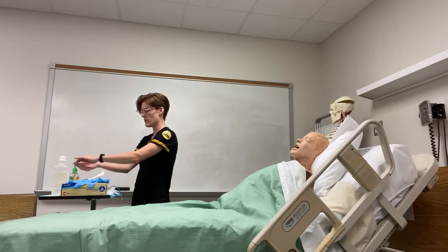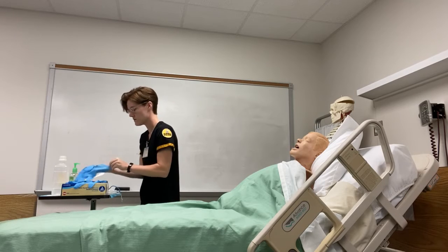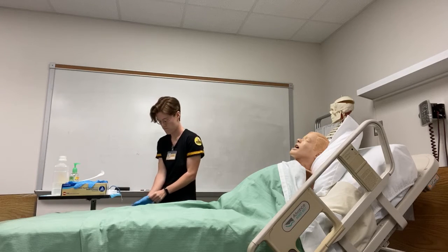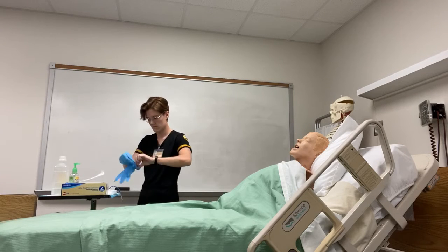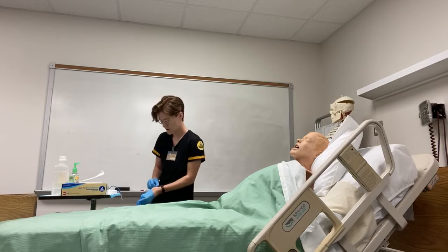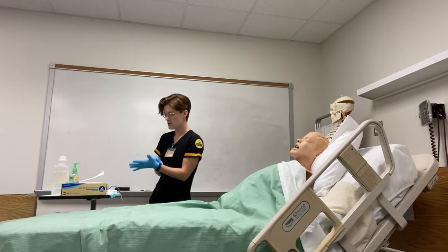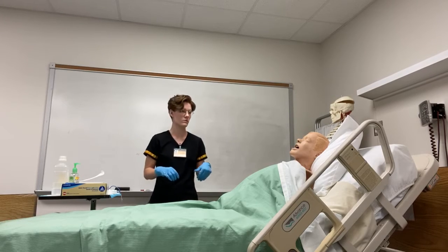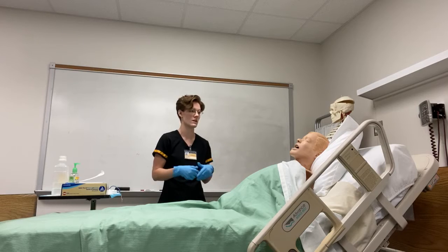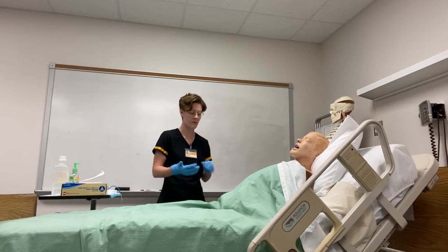so next thing I'm going to do is I'm going to come and wash my hands, and I'm going to apply clean gloves. And did you have any questions before we start? No, I don't think so. Okay, and just to go over some basics, you might feel a little bit of pressure whenever I do insert the tube. It's totally normal. Just let me know if you're experiencing any pain. I would also discontinue the order if the patient showed any signs of cyanosis, they were gagging, or anything was going wrong with that.